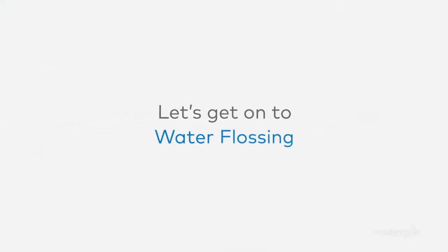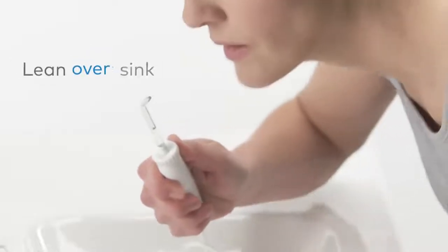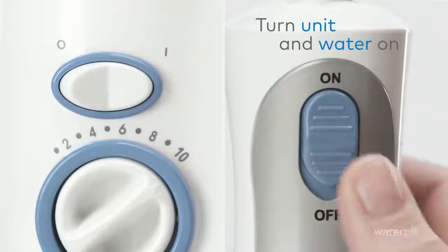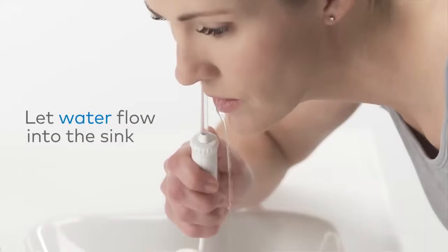Now let's get on to water flossing. Start with lowest pressure setting. Lean over the sink and place the tip in your mouth. Turn unit and water on. Partially close lips to prevent splashing and let water flow from your mouth into the sink.